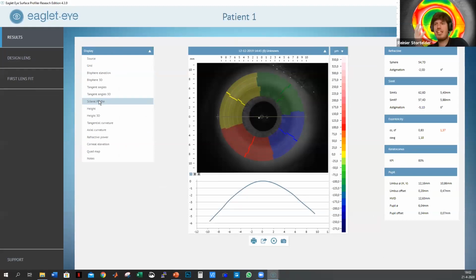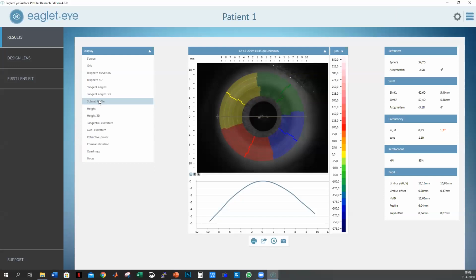It also depends on what lens you want to design. If you're going for a small Blanchard lens below 15 millimeters, you can do it. Barry likes to work with Boston Sclera a lot. For 18, 19 millimeter lenses, you definitely have to yank the lids open as wide as possible. That's a good point.